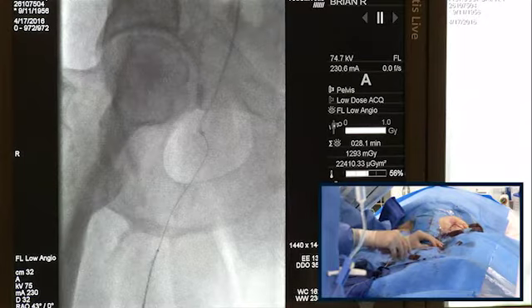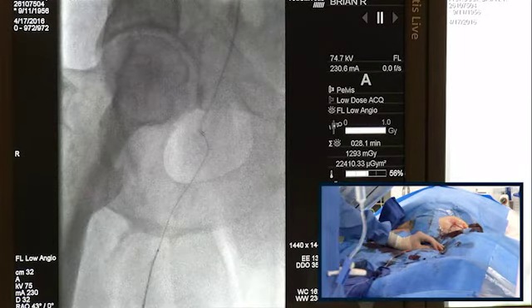The other thing working against this is the very sharp angle of the aortic bifurcation, and at each angle, and we'll talk about that tomorrow in wires, each angle adds a problem in terms of torque. The more of those we have, the more difficult it is to torque, and that really gets amplified sometimes with CTO wires, where we lose some of that penetrance because we just can't move like we want.